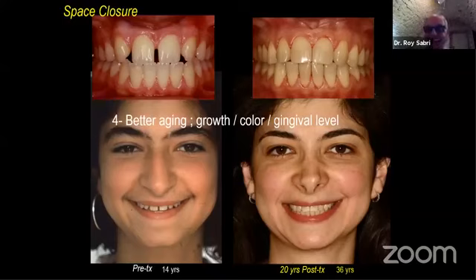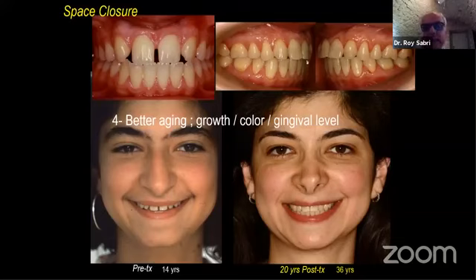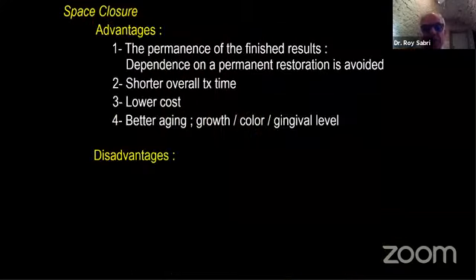The color of the teeth is going to change. The gingival level is going to go a little bit apically. So when you have natural teeth, aging and gingival level is much better than when you have restoration. So that's the major advantage. Here she is 20 years post.